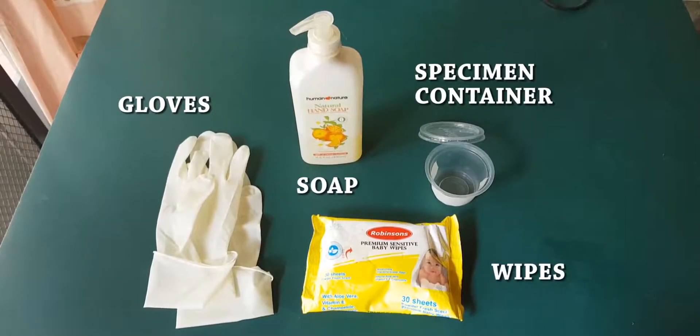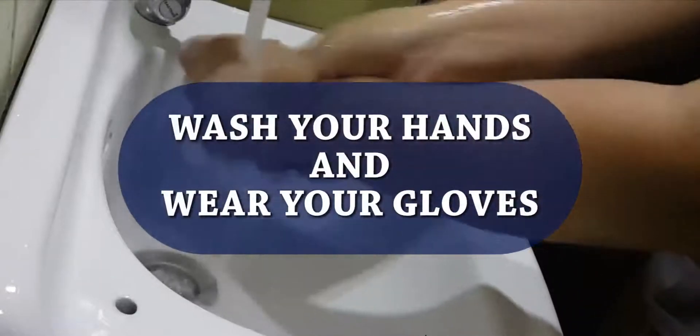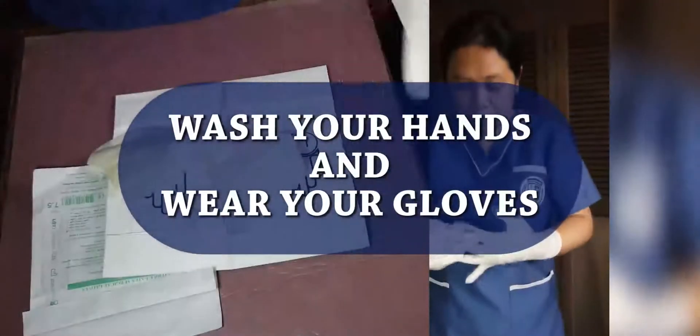Remember that the best time to collect urine is early in the morning. Before doing the specimen collection, make sure to wash your hands properly.